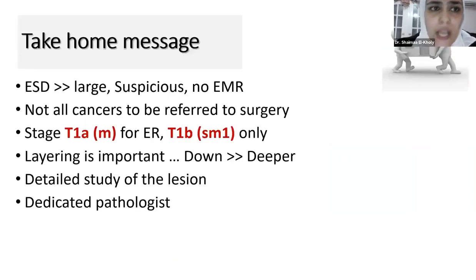So my take-home message is that ESD is for large lesions, suspicious lesions, lesions where EMR cannot be performed. It's no longer that all cancers are referred to surgery, because we see a lot of malpractice where patients with carcinoma in situ, after removing it, go for surgery. It's not for surgery from the very beginning. You have to remember that our limit is T1a. T1b is an extended criterion, or it's controversial. You have to check your lesion in detail, and you have to know the layer, very important.